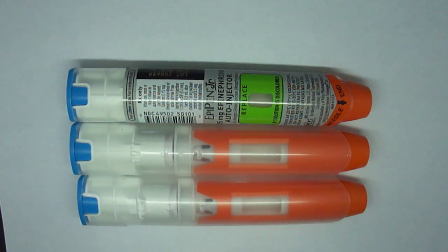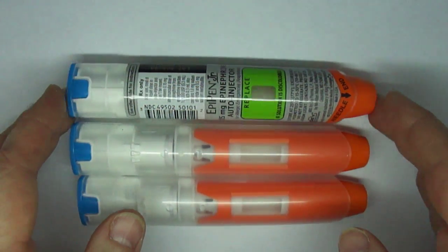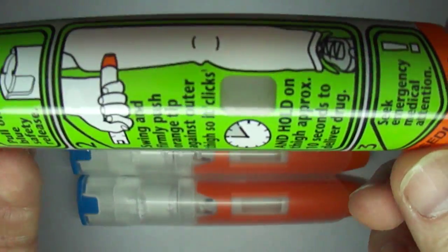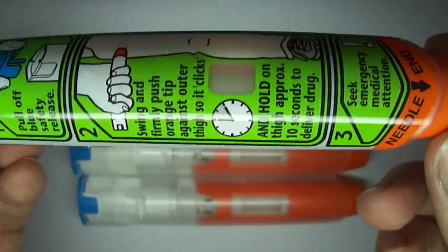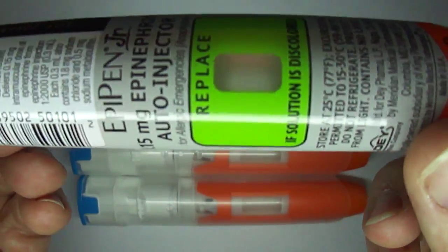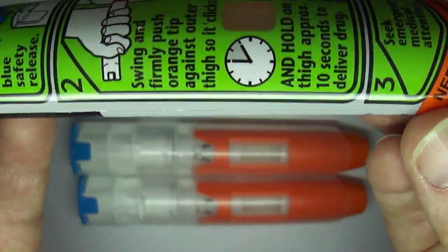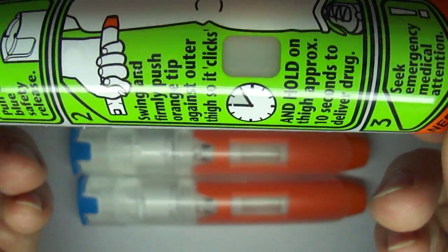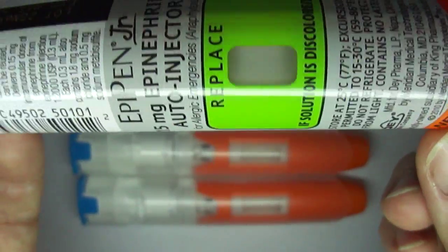Some people have expressed concern when they look at their EpiPen that the window appears cloudy and they are concerned that represents particulate matter. This video demonstrates that this slight cloudiness is normal and in fact represents the plastic covering of the clear glass epinephrine vial.